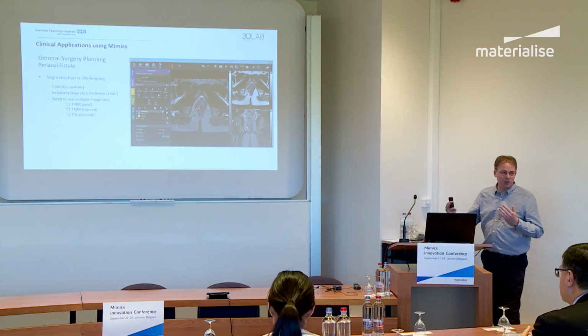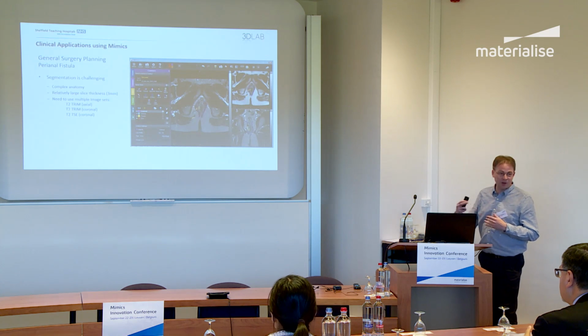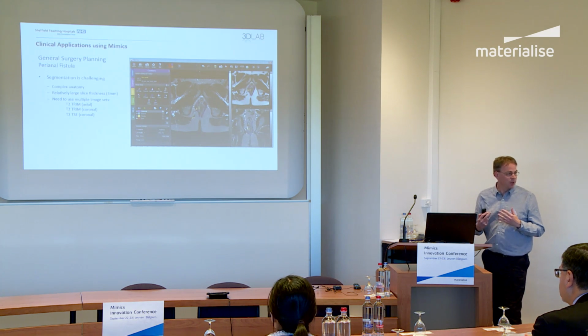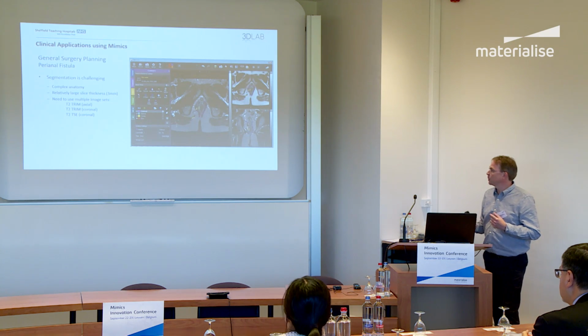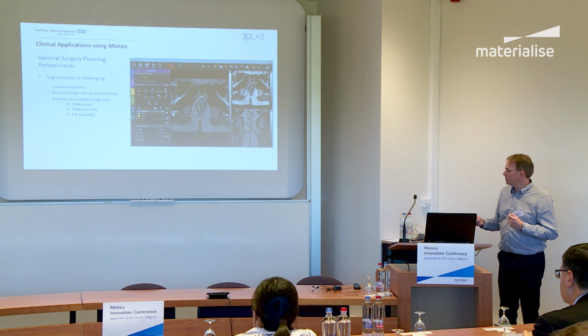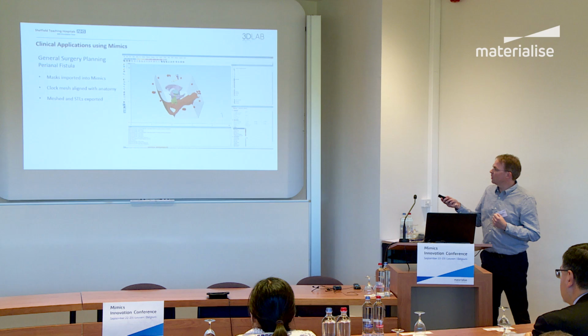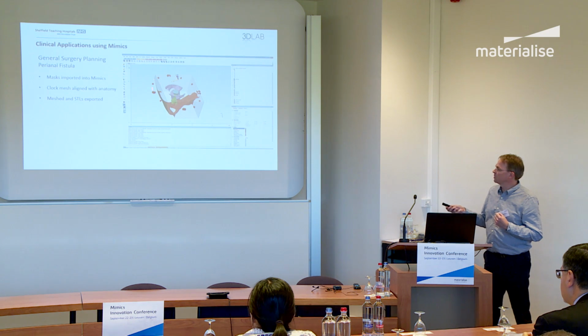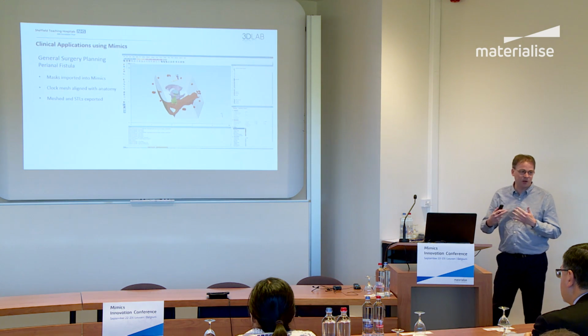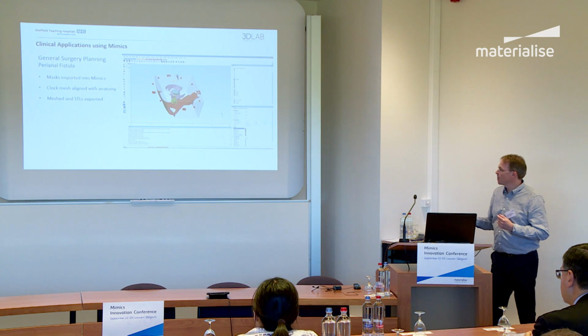And we've actually done the segmentation in different software to Mimics because we need to have multiple images open at the same time to do the planning. So it'd be nice if the Mimics software had that capability where we can import multiple data sets at the same time. But from this we generate masks, and then they're loaded into Mimics and 3-matic. And we add a clock to the model so that they can correlate our pictures with the radiological report.